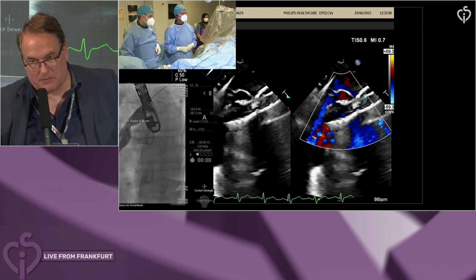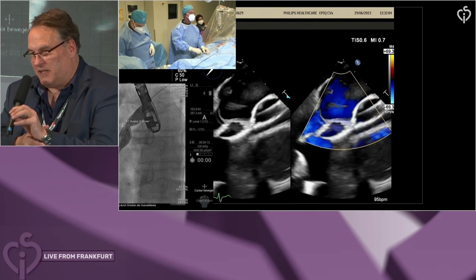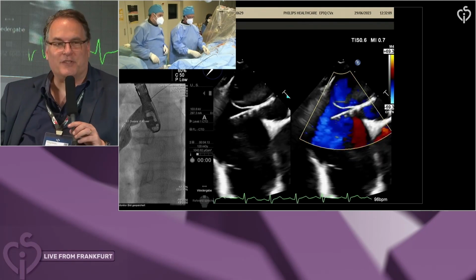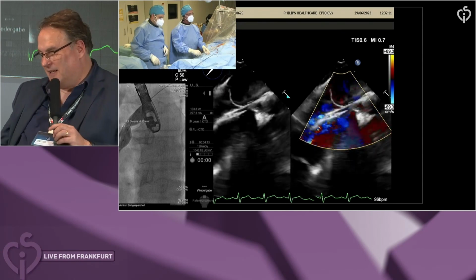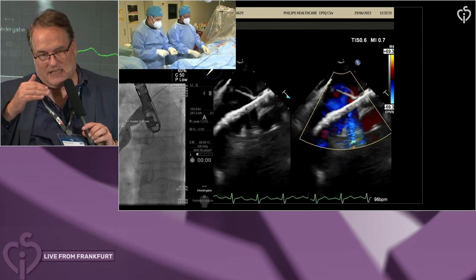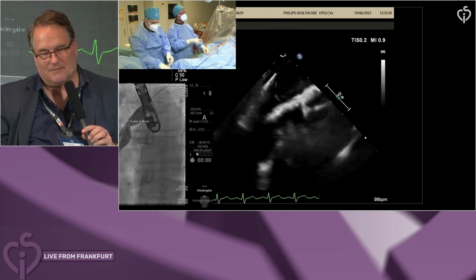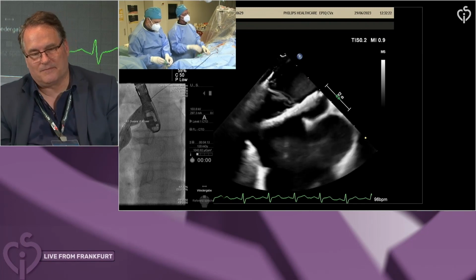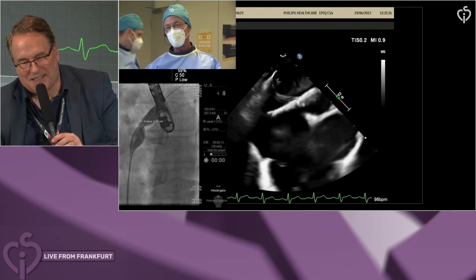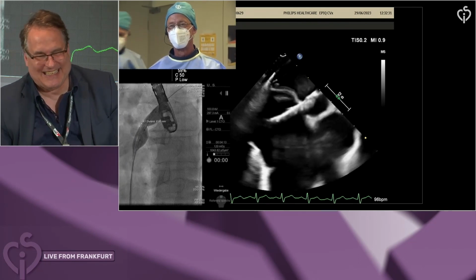And we always have to remember it's like a coronary stenosis. We're just looking in one plane. We're having a summation image. So it can already be larger. If you would turn your C-arm, you would do multiple measurements with different angulations, etc. So when you do balloon sizing, and this is what we tested in the early days before you were even born, there's no difference when you go LAO or RAO. That's nice. I'm older than you think, but it's 1.5 millimeter. It's a compliment.